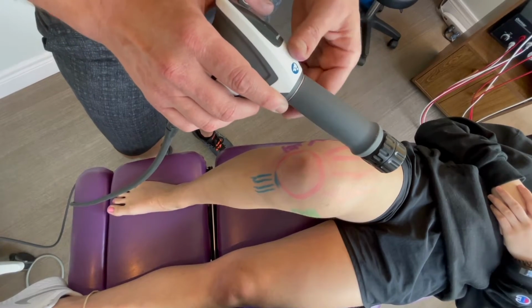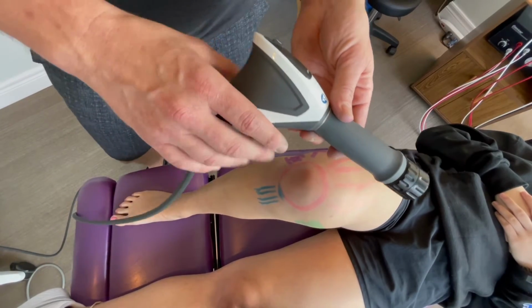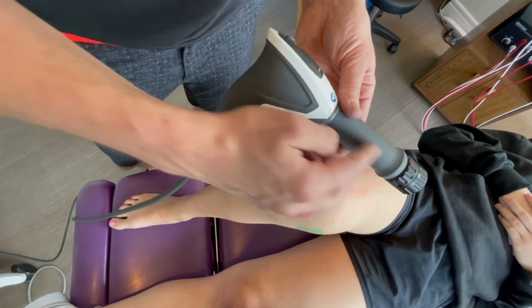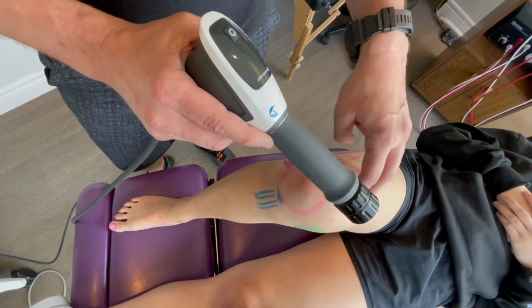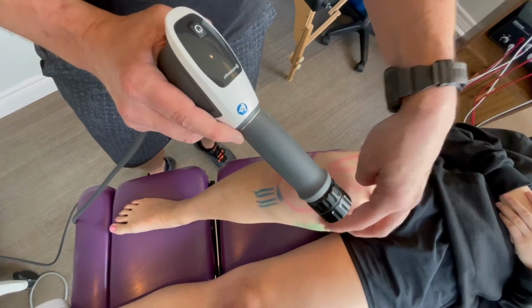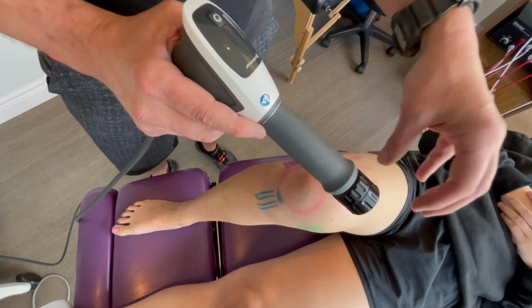After we get the IFC and the heat done, off the patient for 8 to 12 minutes, we go into a thing called Shockwave at the clinic. Shockwave is a pneumatic gun. There's a bolt in a tube that comes across and hits the head here, and it breaks up a lot of scar tissue. Patients love this, especially for knee pain, getting into the meniscus area. With quad injuries, people feel 20% different after the first visit.